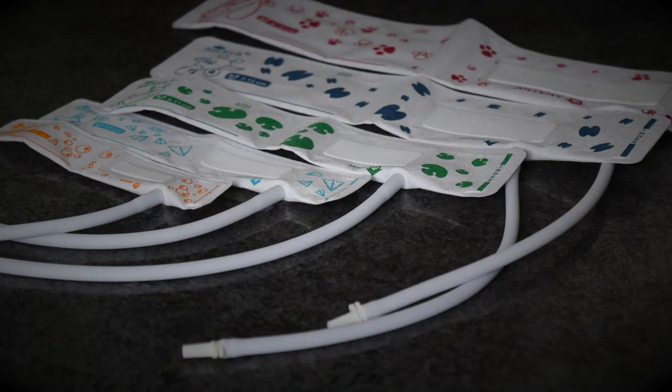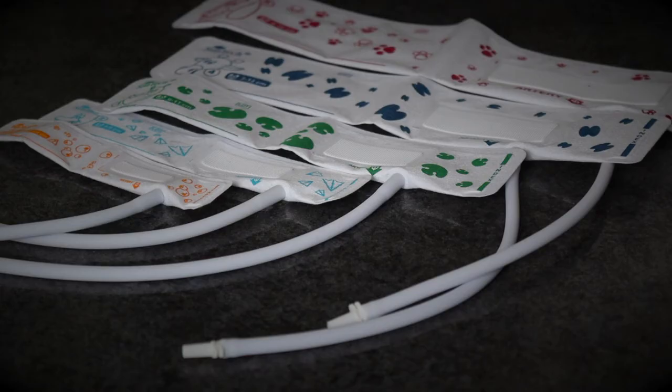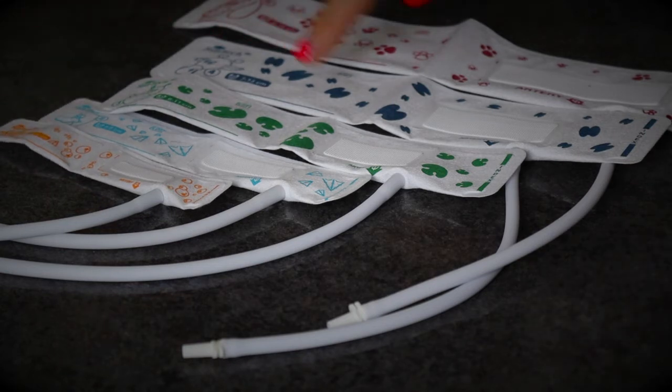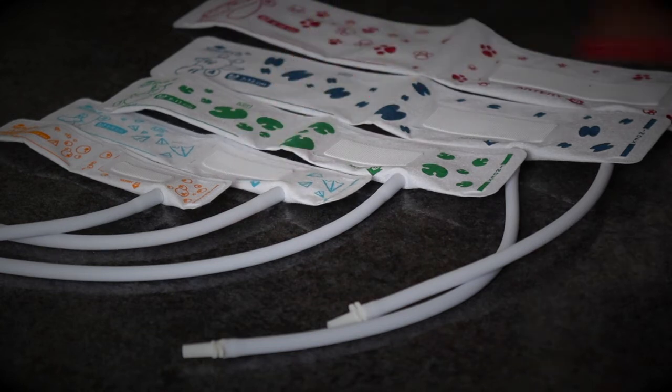These are the blood pressure cuffs that correspond with the EDAN IM60, and it's really important to note what cuff corresponds to what size on the machine. The red one, number 5, is classed as big. The orange, number 1, is classed as small. And your blue, green, and turquoise — numbers 2, 3, and 4 — are all classed as middle. This will become a lot clearer when I show you the machine shortly.